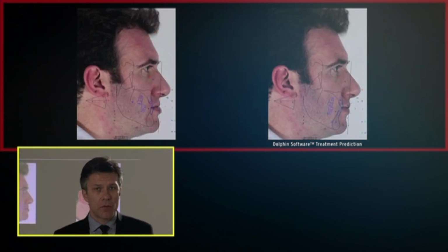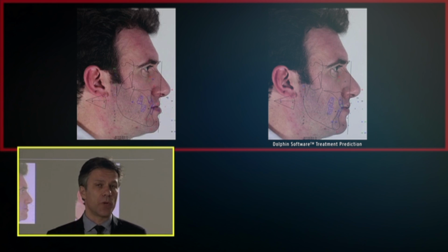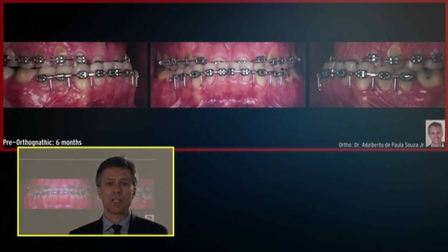So here we can see the preoperative views, and a simulation of the orthognathic surgery with special software.